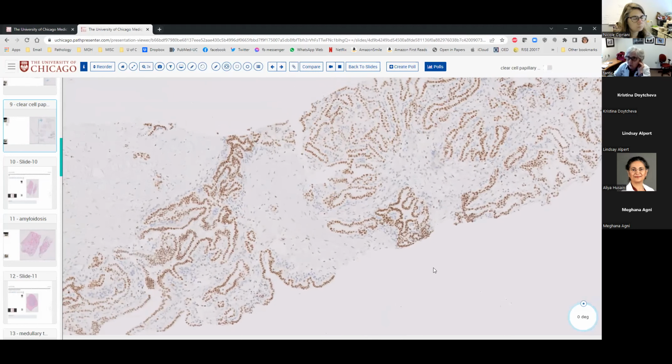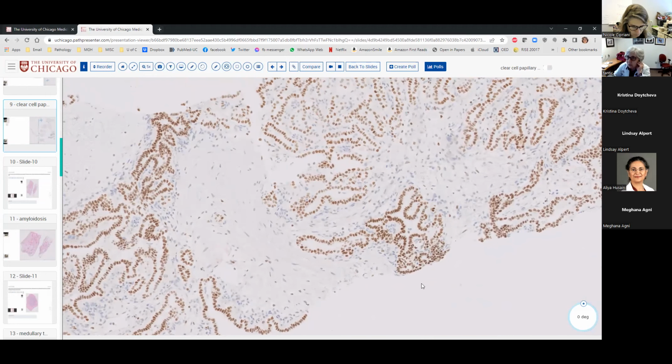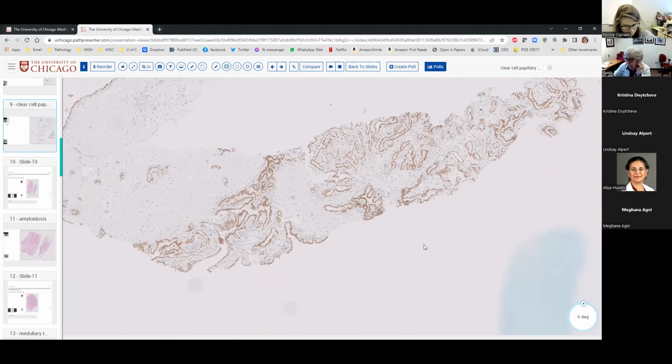There's only one more RCC that stains with GATA3 that is recently described, and it's a papillary with inverse polarity, and it has RAS mutation. Therefore, that's another one that stains with GATA3, but that one wouldn't be positive for CA9. Therefore, we have clear cell papillary staining diffusely for CK7, nice cup-shaped CA9, and GATA3, with morphology and this immunohistochemical profile. That's the diagnosis.